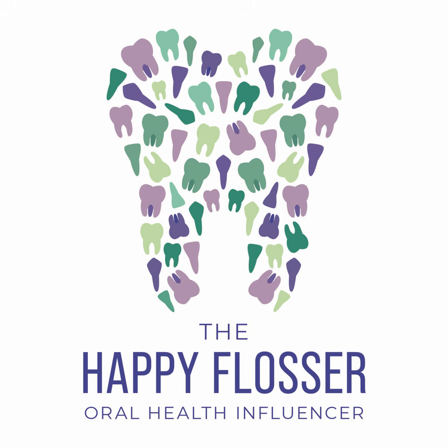Okay, so think about your whole grayscale. And when you're looking at a radiographic image, rather than looking at your overlap and your cone cut and did you place the sensor correctly, I want you to just take a moment to really think about the science behind the image, the density that's involved with how that image shows up on the sensor.